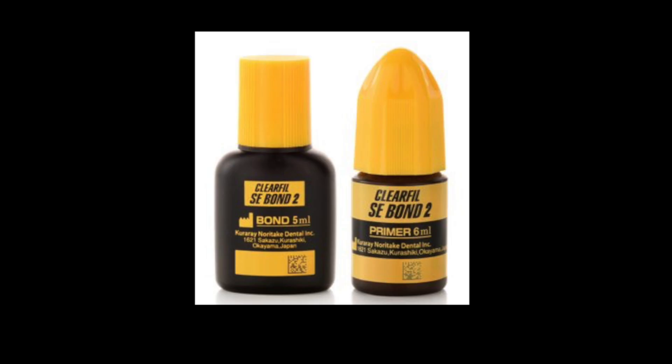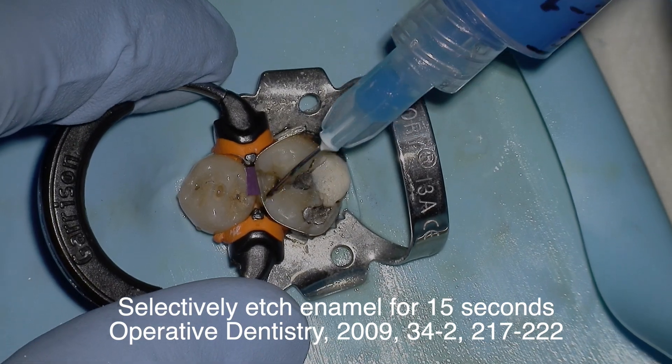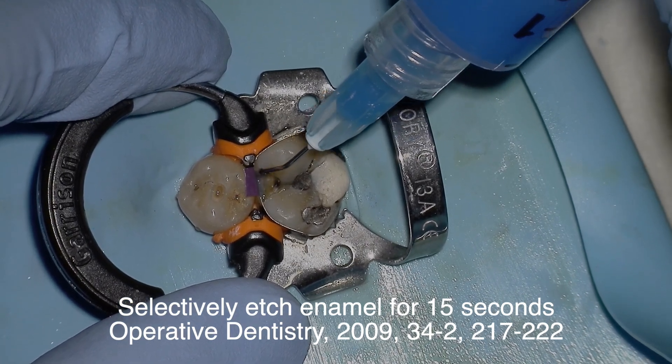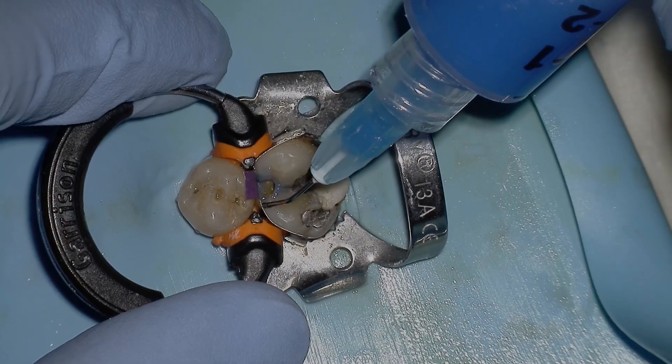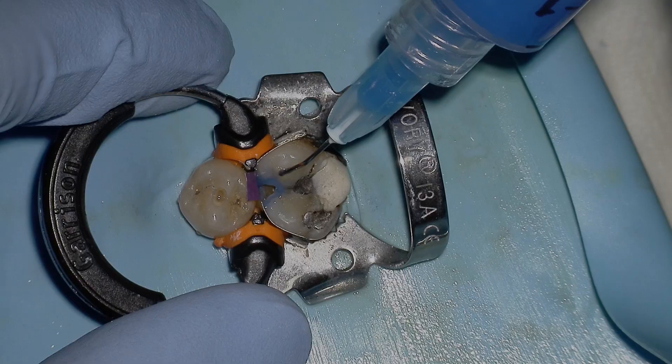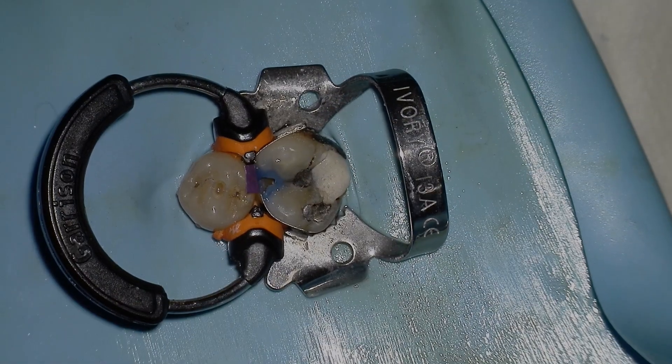Tip number eleven: check the manufacturer's instructions for use — this is critical, because what you were taught in school may not be how the company designed it to be used. In this video we're using ClearFil SE, and we're going to selectively etch the enamel for 15 seconds to increase the potential for better bonding of the bonding agent to the enamel.